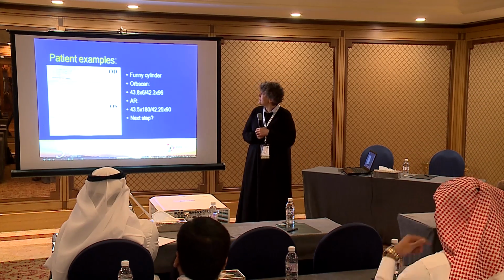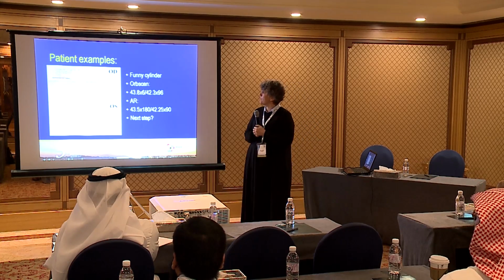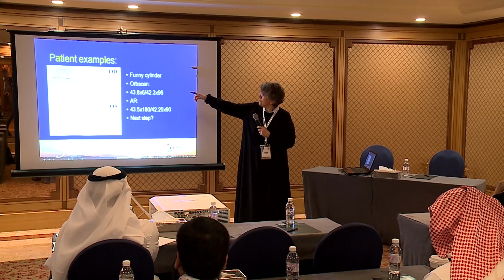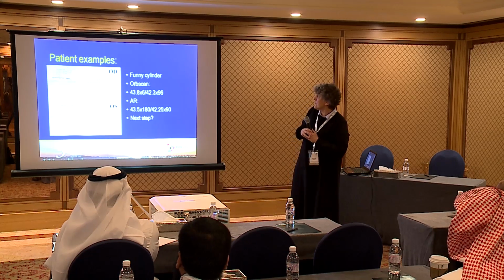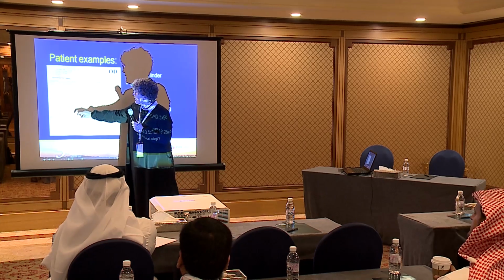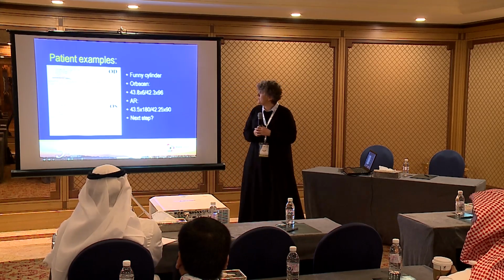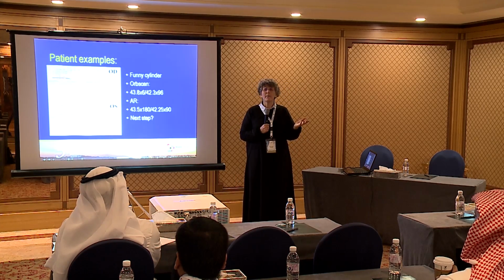This is a lady that I've been treating 4 generations of her family. She came with a cataract, and then she was measured. And the measurement shows us that she has a cylinder of 2.37 diopters. I don't know if you can see it. In the right eye, here, it's 2.37, it says, and here it's 0.59. That's odd, because she didn't have it in her glasses, and it surprised me. So I didn't buy this. I went to my technician and told her, what happened here?